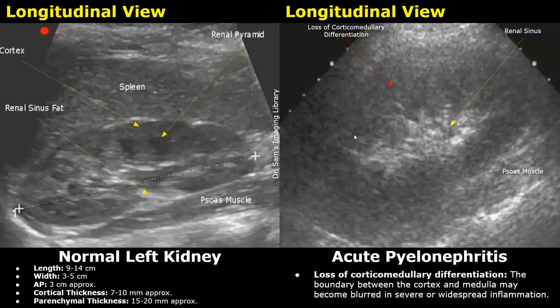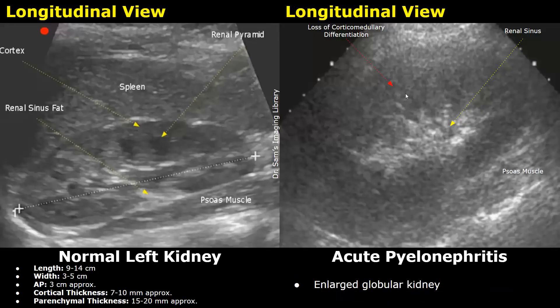This loss of corticomedullary differentiation, along with symptoms such as fever and flank pain, can indicate acute pyelonephritis. In the normal image we can clearly differentiate between the cortex and the medulla, whereas in the affected image we cannot. This kidney is also enlarged and appears somewhat globular in shape instead of elongated, which can occur in acute pyelonephritis.